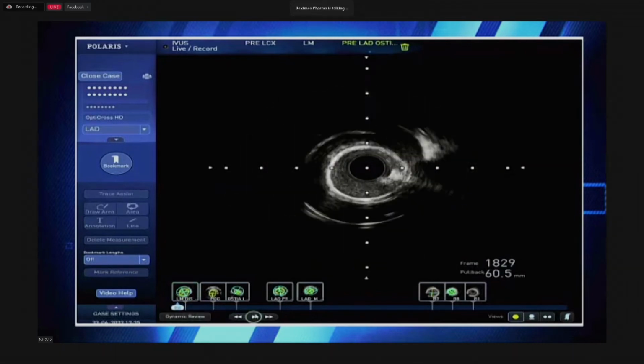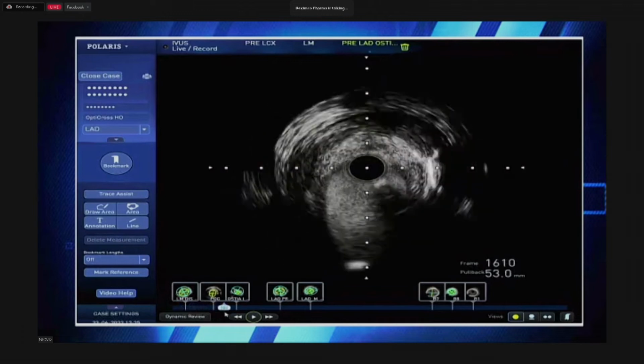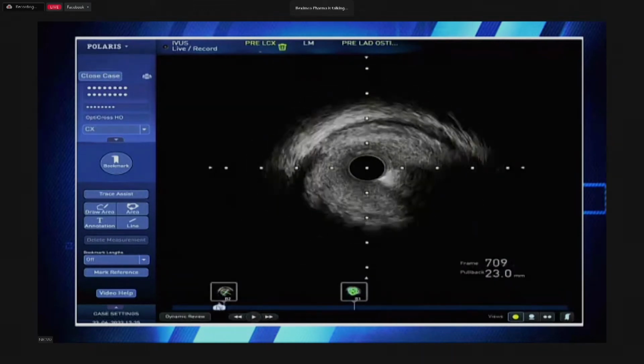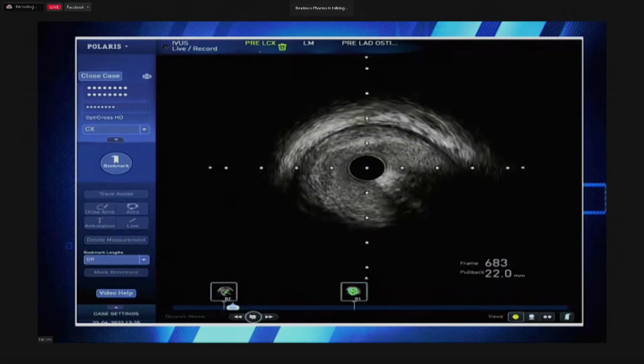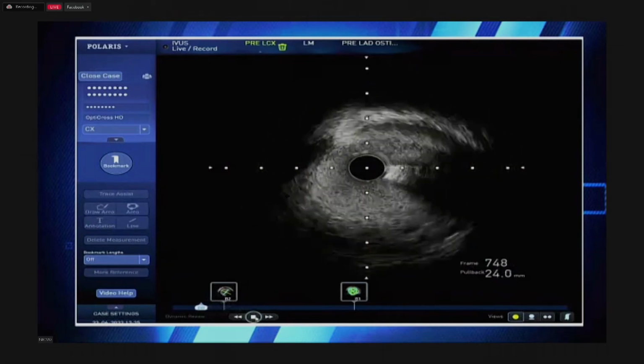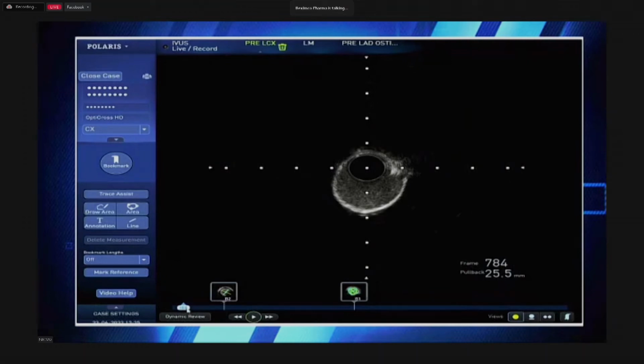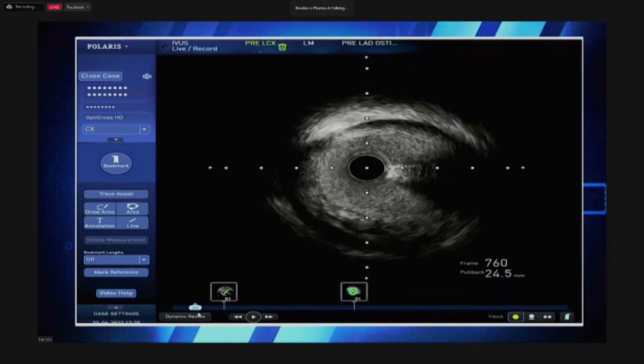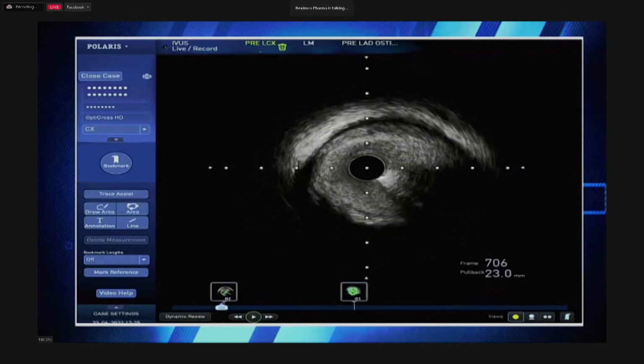So there, if we stop the IVUS there, just before the guide catheter, okay? Just before the guide catheter. So that's your disease-free segment, right? Just before you enter the guide catheter, this is your disease there. That's fine. That's the aorta, but that's fine. Come a little distally, a little more distally, stop right there. Okay, so now you have a relatively disease-free segment within that distal left main.